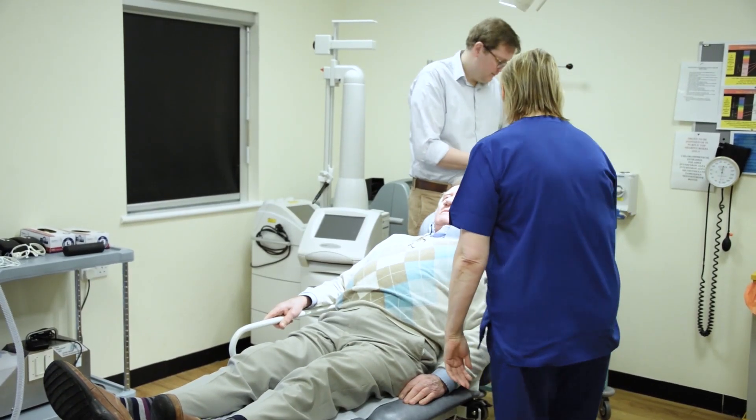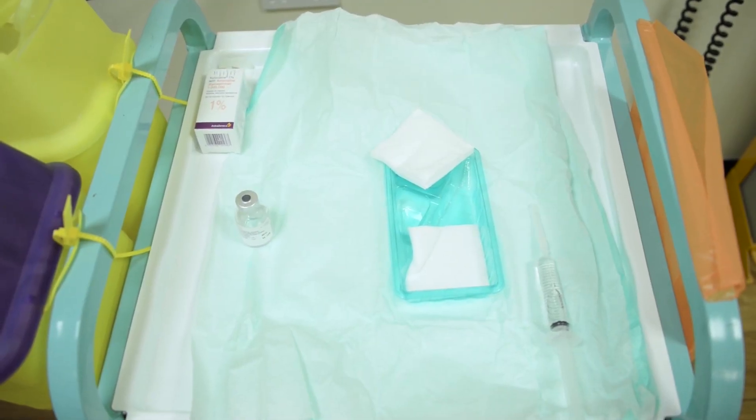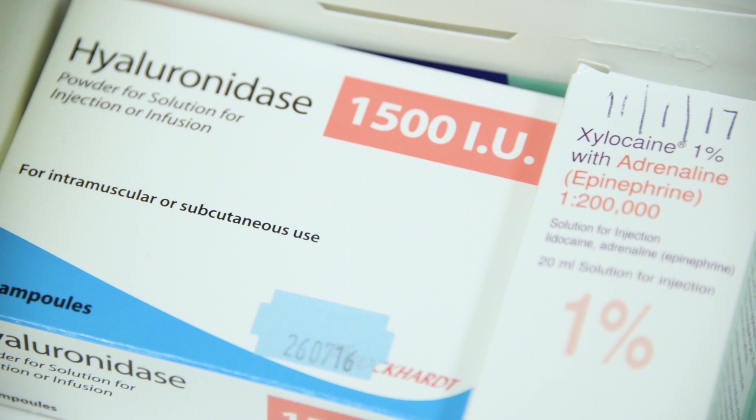When the patient is settled comfortably, the nose is prepared with antiseptic solution, and local anaesthetic, which is a combination of short and long-acting anaesthetic, is injected prior to the treatment.